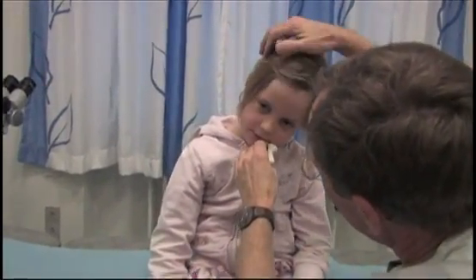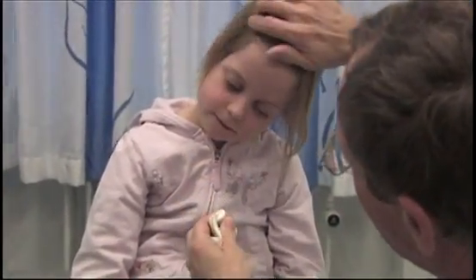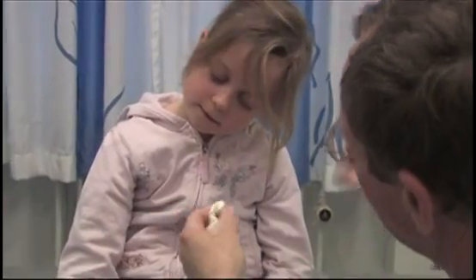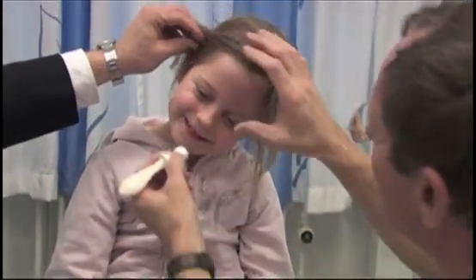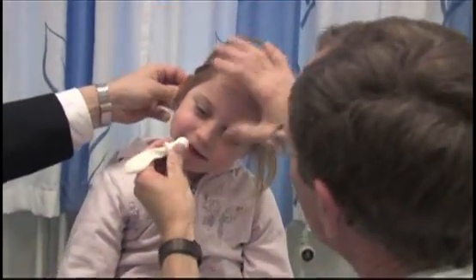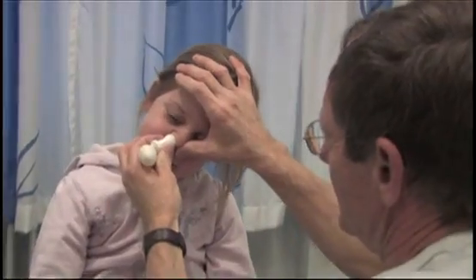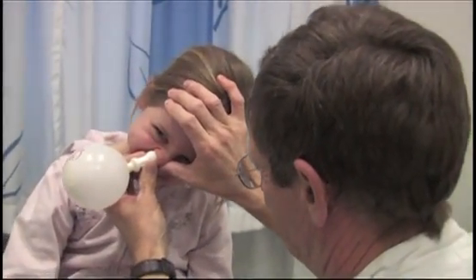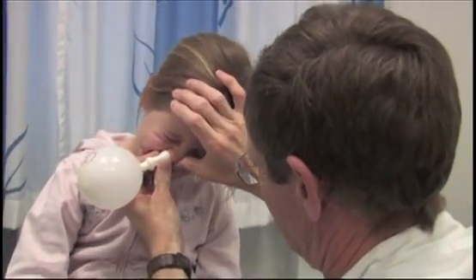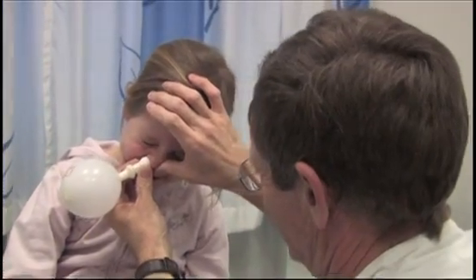Next, she tries the inflation herself with the help of the doctor. In many cases, the child will feel a click or a fullness in the ears during the first inflation and an immediate improvement in hearing.